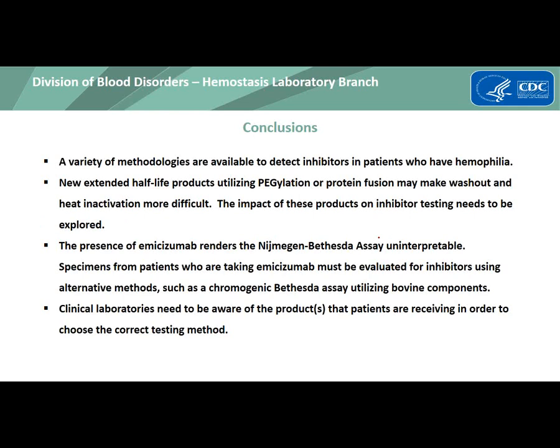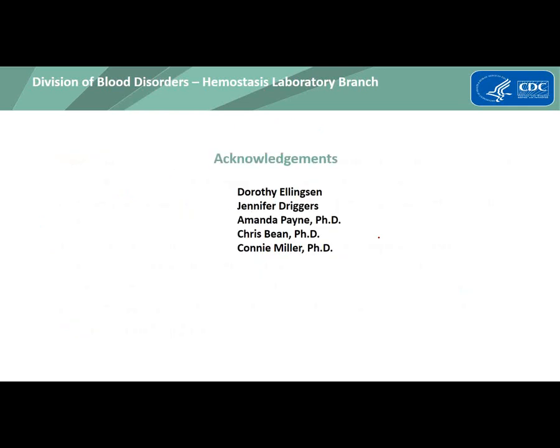And then finally, clinical laboratories need to be aware of the products that patients are receiving in order to choose the correct testing method.